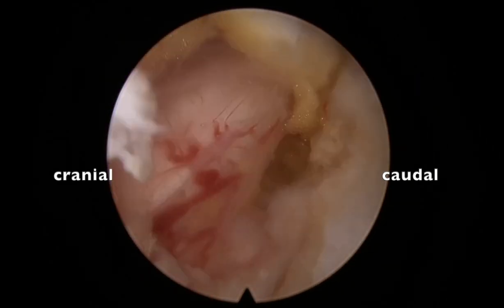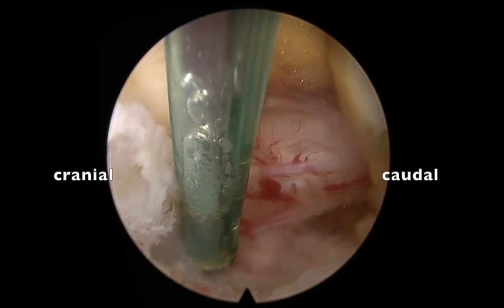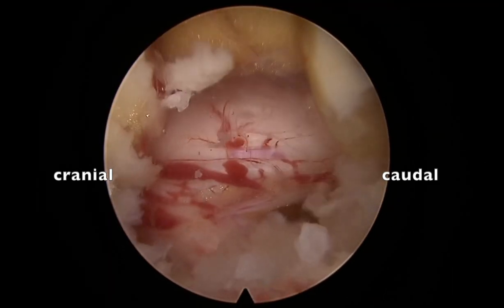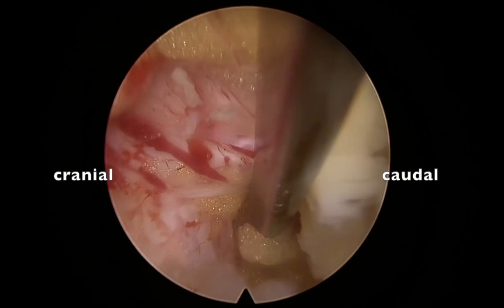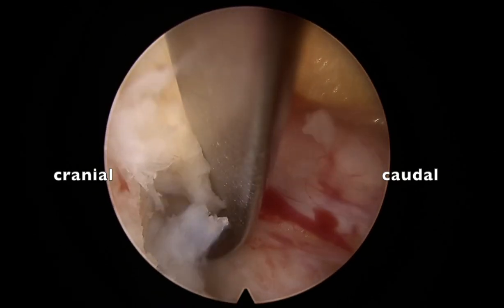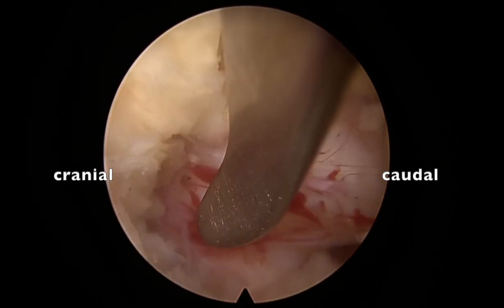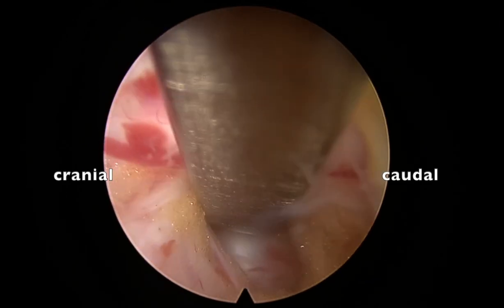Remove the fat or flimsy layer lateral to the root — that's the edge of the thecal sac. One unusual thing: the traversing root is completely transverse. Normally the traversing root is oblique, but here it is completely transverse — a horizontal orientation of the root. This happens when there is an axillary fragment or osteophyte which pushes the root more horizontally. You can see this disc or hard osteophyte has pushed the root.